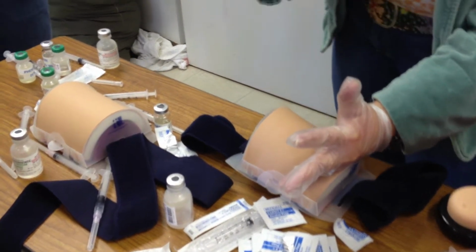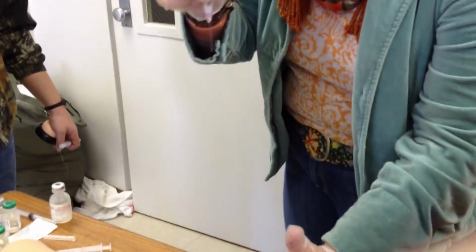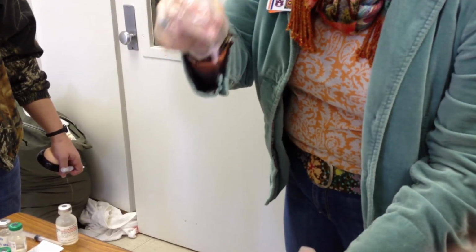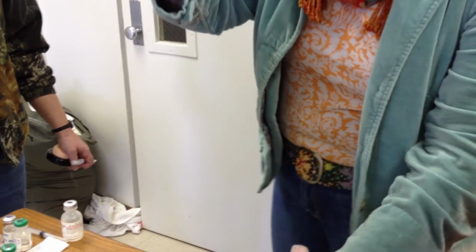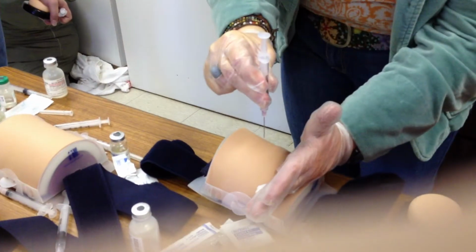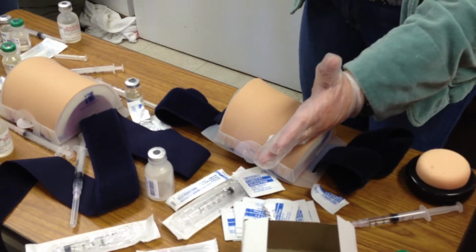Okay, so I'm still displaced. I'm going to turn my bevel toward me, because when you're saying the rule is always bevel up, well, I don't know what up is on 90 degrees. Is it toward me or is it away from me? I don't know. So I always turn my bevel toward me because you just want it to be point down. And this is a 90-degree technique. So you're going to go in like a dart, 90 degrees into the skin. Use your wrist to dart in.